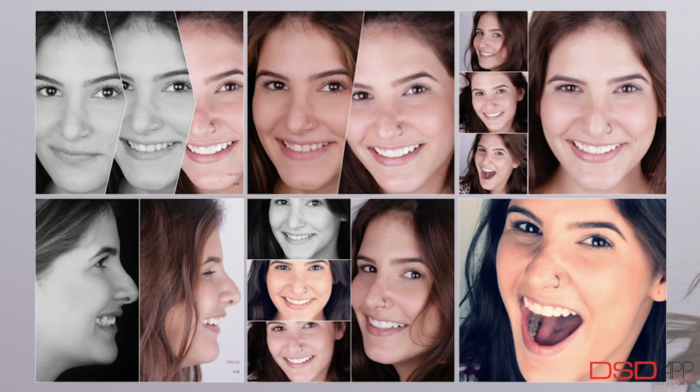What are the benefits of creating a motivational mock-up for your patients? There are two main reasons why we want to integrate the motivational mock-up in our patients' workflow. First, the motivational mock-up is meant to create an emotional connection between your patient and their new smile, and ultimately you as their dentist. Aside from increasing case acceptance, this mock-up will also help create this relationship between you and your patients based on trust and respect.